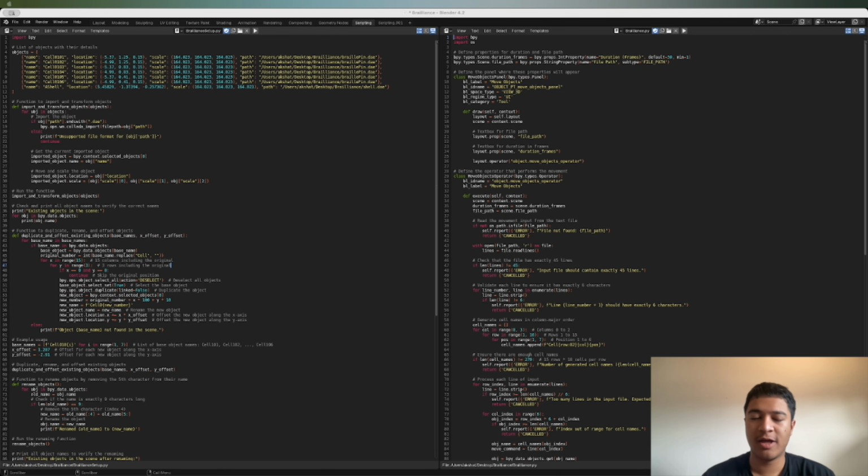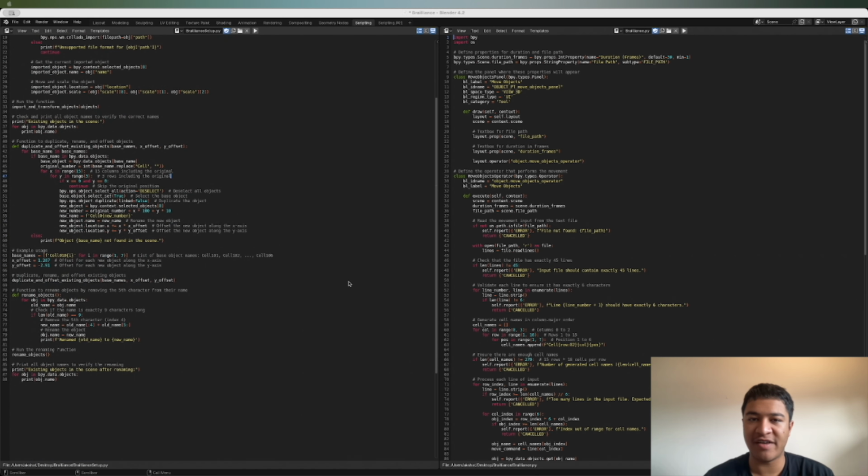Thank you, Riley. My name is Akshat, and I'll take us through the final phase of Brailliance, our Braille board. In lieu of a physical model due to the time constraints, we opted to make one on Blender. The left Blender window showcases the Braille setup program, which automatically generates a 15 by 3 pin Braille board for a total of 45 pins.